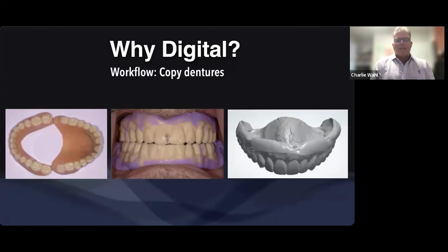Because whatever bite we scan, that's the bite, which translates to the jaw relationship in our digital patient, right? If we scan a patient at MI, that's what comes on the computer. If we scan a patient in CR, that's what comes on the computer. If we do a protrusive bite, that's the bite that the relationship of the upper and lower jaw get mounted in. So I have something I can use. I can use a Gothic arch tracer.